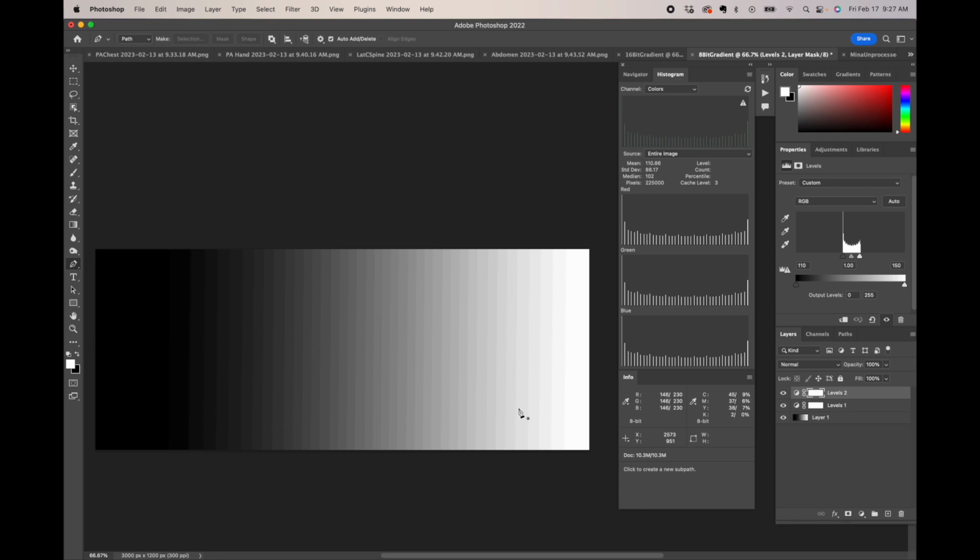Since we can't make adjustments and we don't really have a choice as to whether the adjustments are being made in 16-bit or 8-bit, we're just taking and sending what the image is giving us, and we can make some adjustments prior to sending it to the radiologist. We're still somewhat limited as to how the machine chooses to do it.